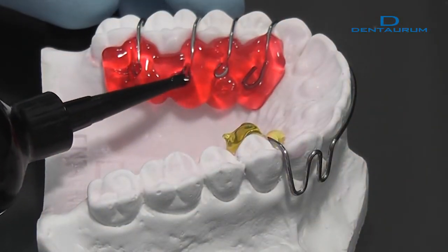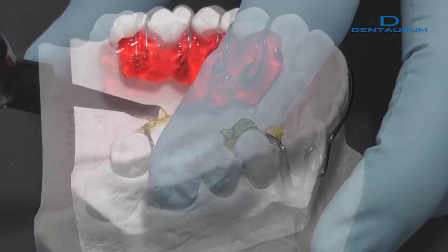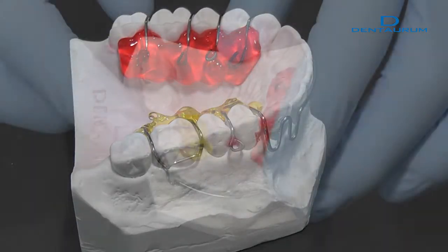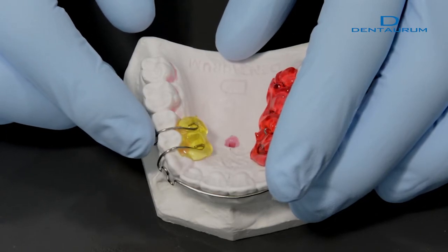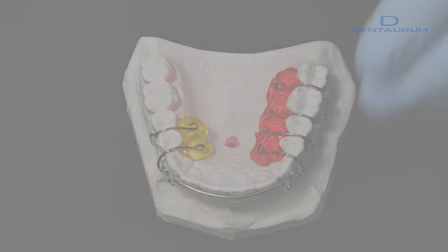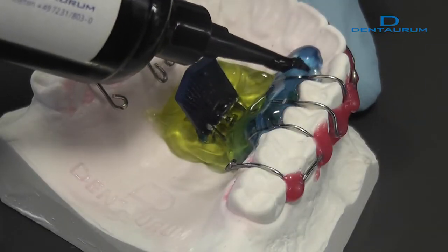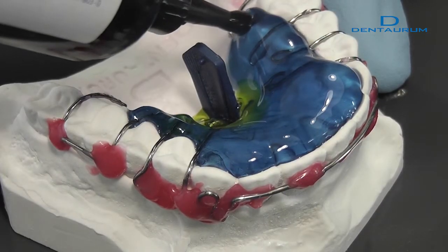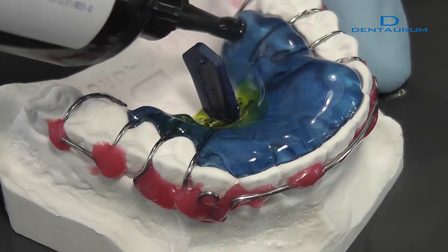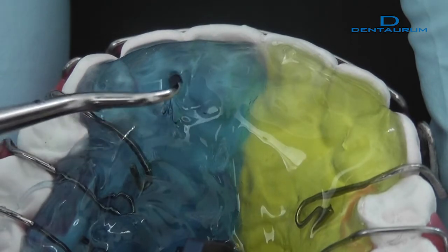Wire elements can also be fixed using OrthoKryl LC instead of sticky wax. To prevent air bubbles from forming, make sure that the tip of the cartridge is always positioned so that it dips slightly into the acrylic. A sharp instrument can be used to remove any air bubbles that have formed.